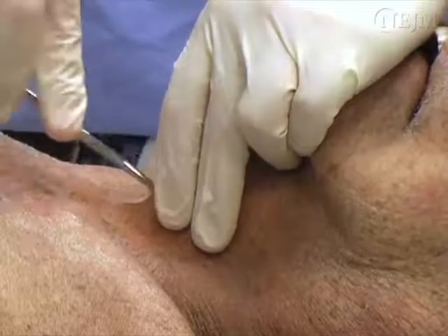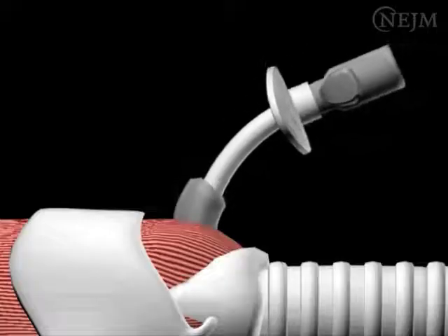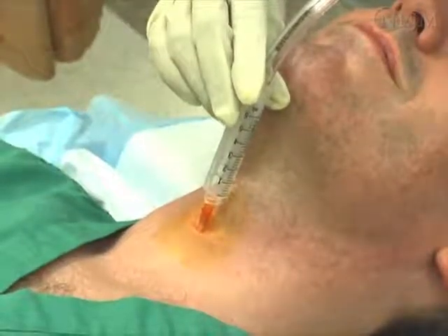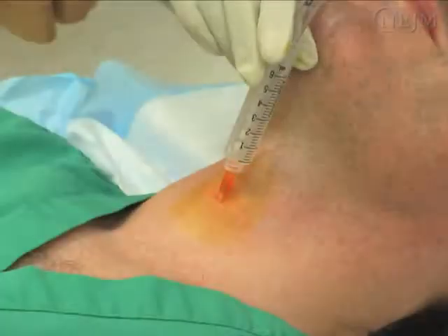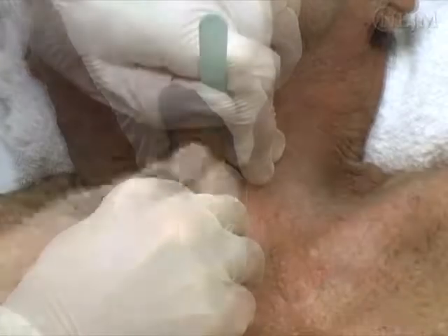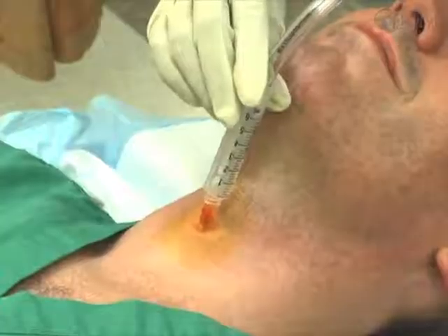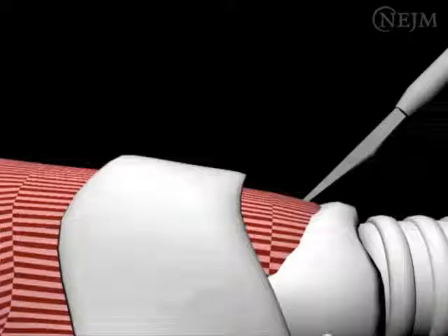This video will demonstrate surgical cricothyroidotomy, which involves placement of a tracheostomy tube through an incision in the cricothyroid membrane. In needle cricothyroidotomy, a catheter is placed over a needle into the cricothyroid membrane, allowing ventilation by a pressurized stream of oxygen. Because the catheter has a smaller diameter, it is less effective in providing adequate ventilation and should only be used as a temporizing measure while preparation is made for surgical cricothyroidotomy or tracheostomy. Needle cricothyroidotomy is the preferred method of establishing an emergency airway in children younger than 10 to 12 years, since the larynx is more easily damaged by surgical cricothyroidotomy in this age group.